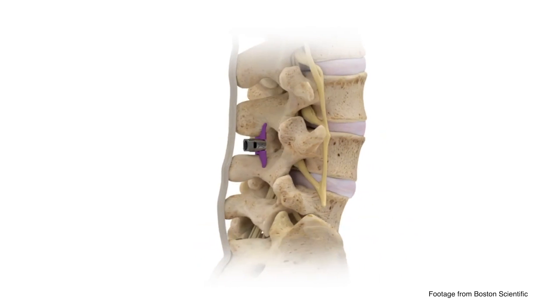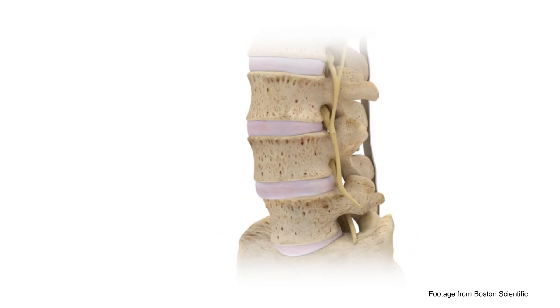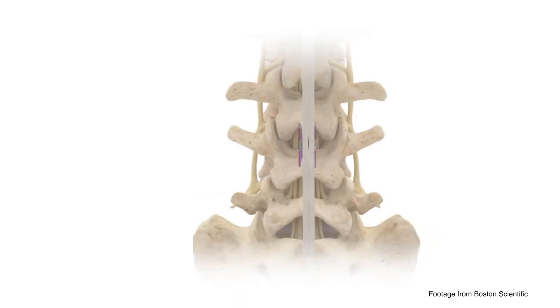The Superion Interspinous Spacer is an implant designed to fit between the spinous processes of the lumbar spine. It is indicated for the treatment of neurogenic intermittent claudication due to moderate lumbar spinal stenosis. In this video, we'll demonstrate the surgical technique for implantation at the L3-4 and L4-5 levels.